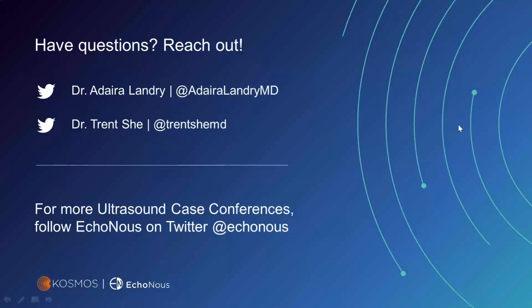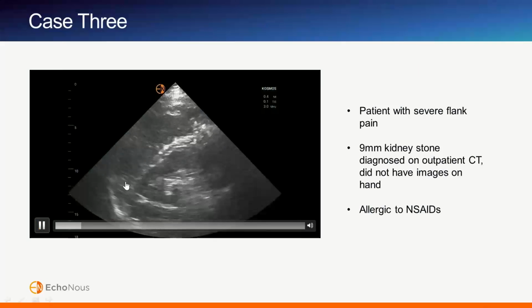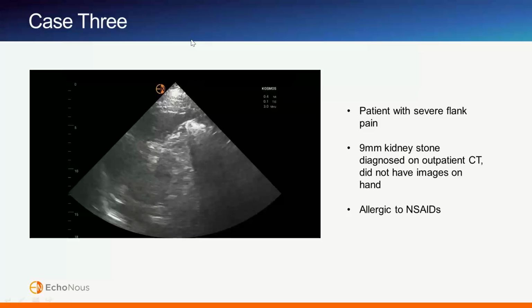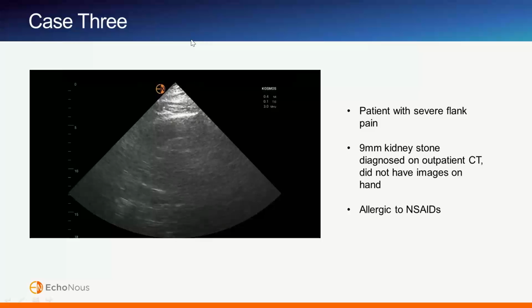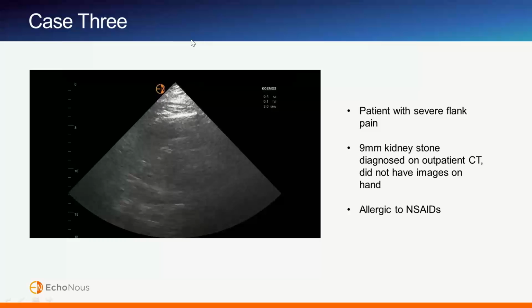And before we go, let's answer the two questions that we see here in chat. The first question I see is regarding the last case, the kidney case. Did you happen to get a clip of the left kidney? So I'm just gonna bounce back. This is a clip of the left kidney. Oh, no. This right here is the spleen. We did get a clip of the right kidney as well. And we did end up getting clips of the bladder. Strangely enough, they were all completely normal. I did not see any signs that there were stones in the UVJ, but this was the representative image of the patient having some left-sided flank pain and just having no hydro in the left.